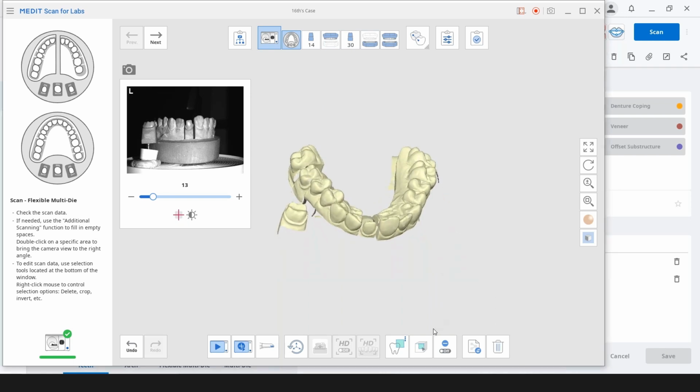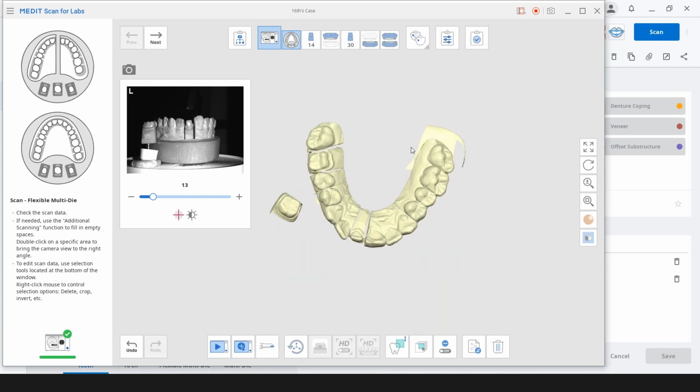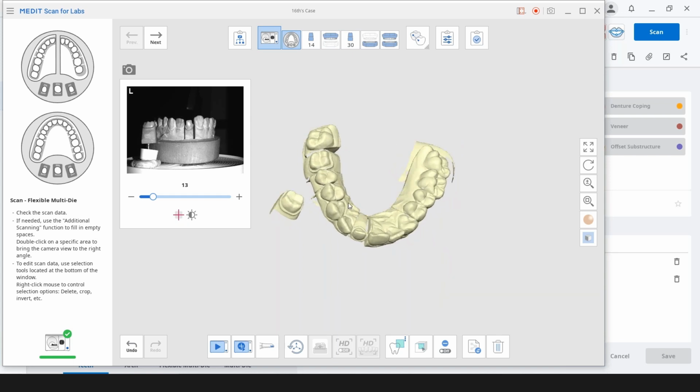That undo button is vital. Yeah, it's good to have. So yeah, you can spend more time trimming around here and getting exactly where you want it. That should be fine for our purposes. Okay, so then I'm going to go to the next button.